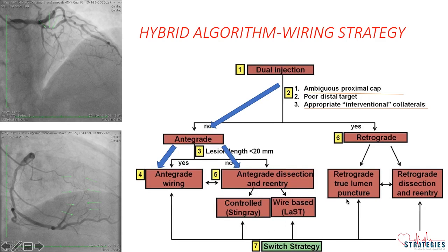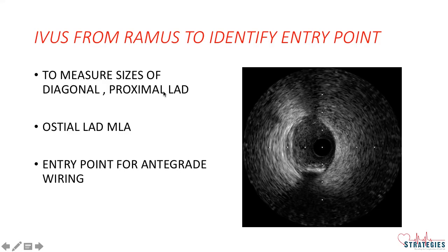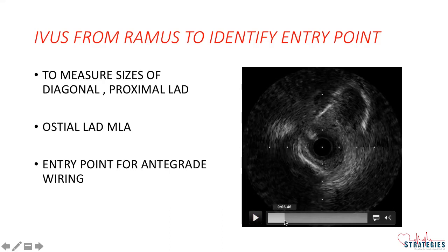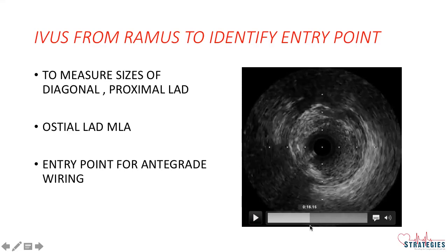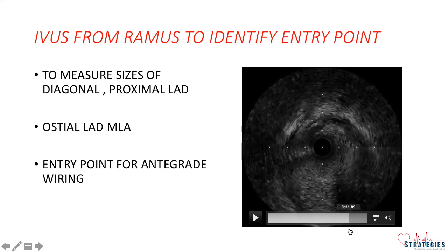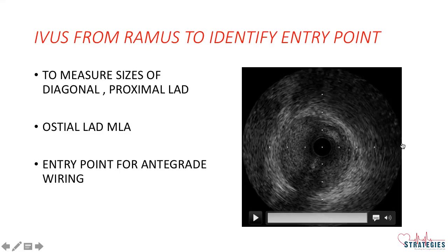If this does not work then we may have to go retrograde to complete the procedure. As a part of analysis, we did IVUS from RAMUS to identify the entry point, to measure the sizes of diagonal and proximal LAD, to see the ostial LAD plaque, whether to include ostial LAD into stenting or not, and also the entry point for antegrade wiring. From RAMUS you can see this is the entry point for LAD, and this proximal LAD is showing a good-sized vessel almost 4 mm, and this is ostial LAD with mild plaque but overall luminal area is looking good.